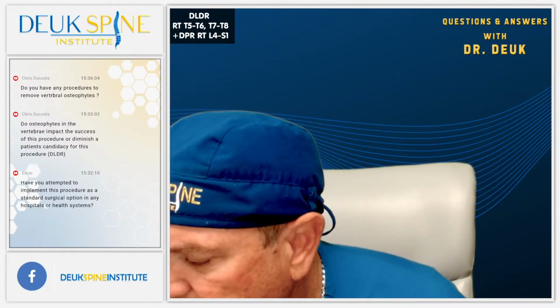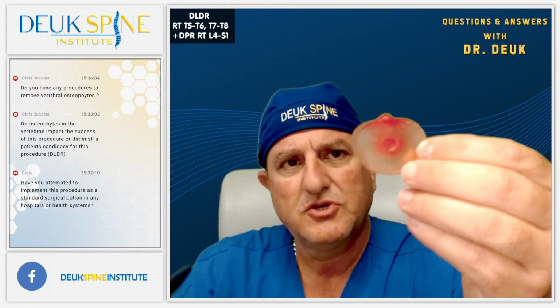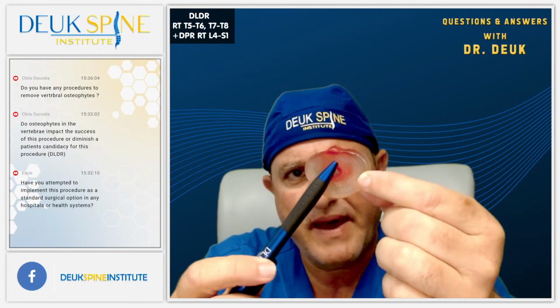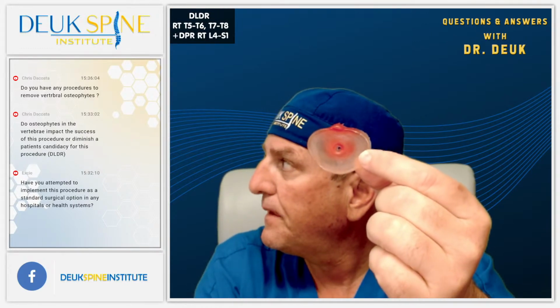All right, let me see if I can show you. Can you guys see this little thing? Yes. Okay. So this is a disc, all right? And the wall of the disc is fine except where there's a tear in the back and the herniation is sticking in the tear right there. You guys see that? Yeah.